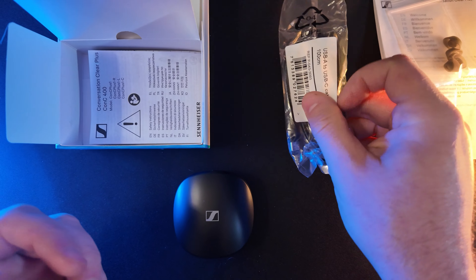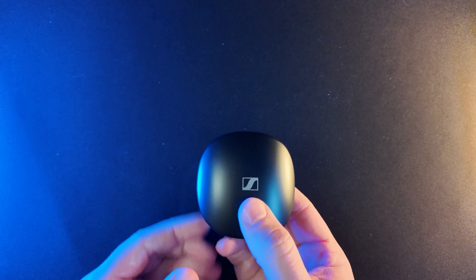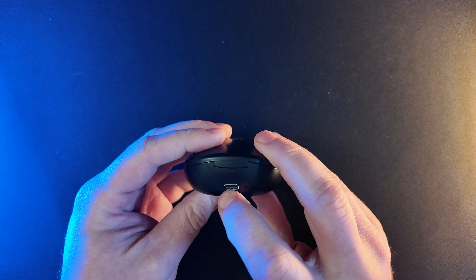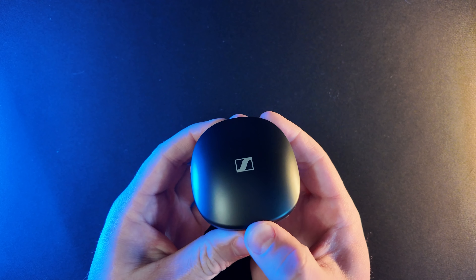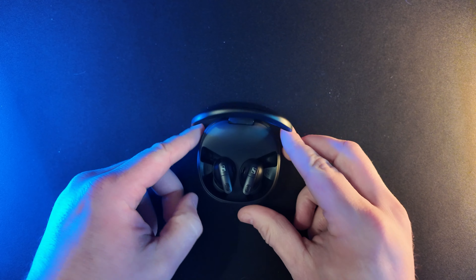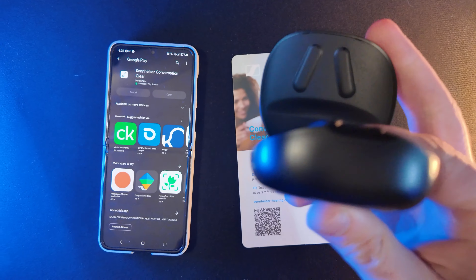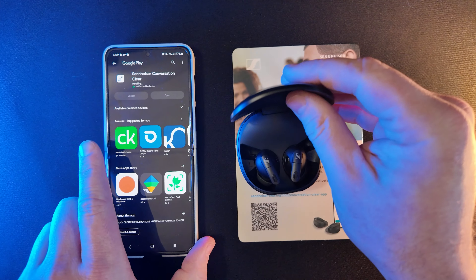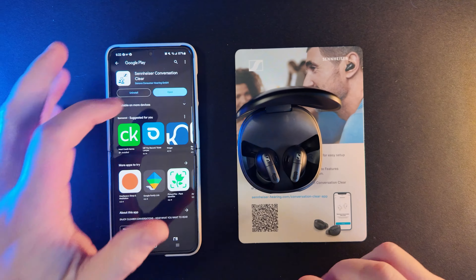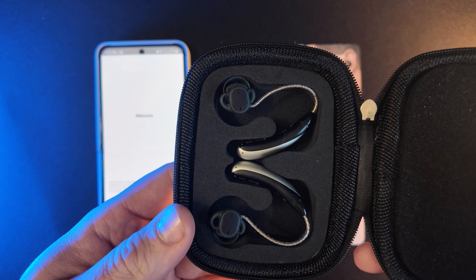Or hearing aids — not earbuds, though they are buds that go in your ear. Here's the fin kit, here are the different tips, and the USB-C cable, which seems pretty lengthy — 100 centimeters, so one meter, or 3.3 feet, freedom units. Here's the case itself — just like a little pebble, with a USB-C charging port on the bottom. It flips open, still nice and easy, and shows the hearing aids right inside.